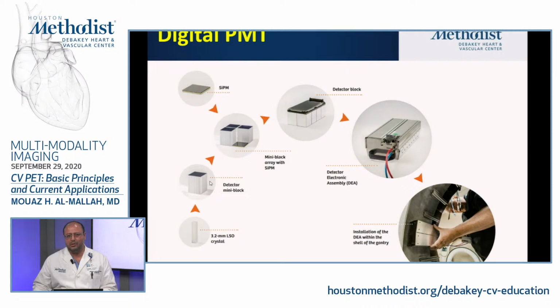So what you saw in the initial image is that these blocks are a full group of these different crystals, and on top of these we now have the digital system, and they come into a full unit, and this is what you put around the patient.